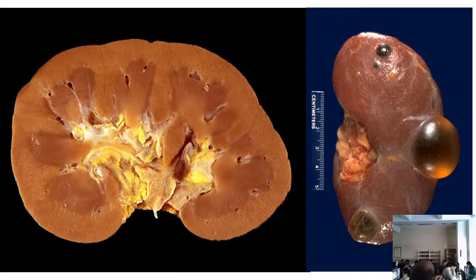The distal convoluted tubules come close to the glomeruli, and they have some specific cells named macula densa. And this is the juxtaglomerular apparatus, which controls the consistency and the amount of the urine and possibly secretes renin. That's why most renal diseases affecting the quantity and quality of the urine produced are potential causes of secondary hypertension, not the idiopathic hypertension, the common one, but nephrogenic hypertension.